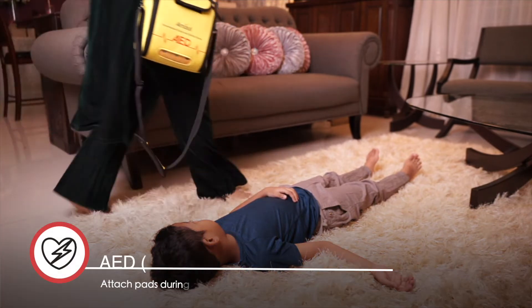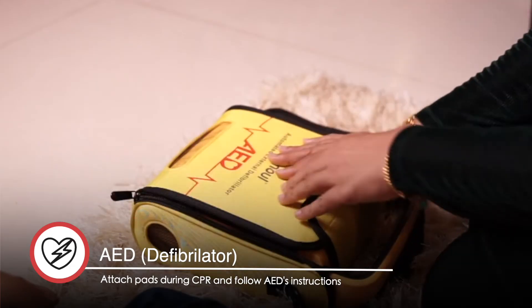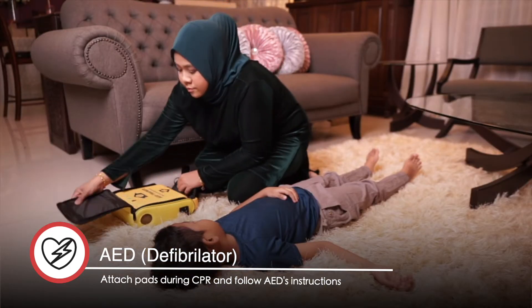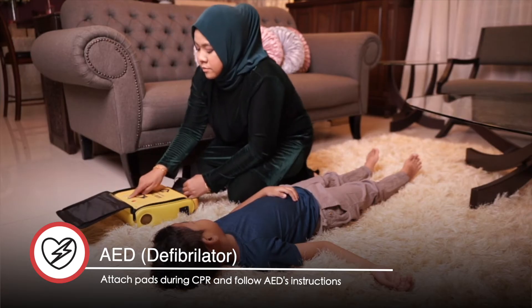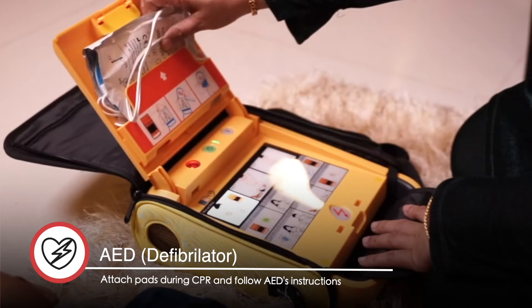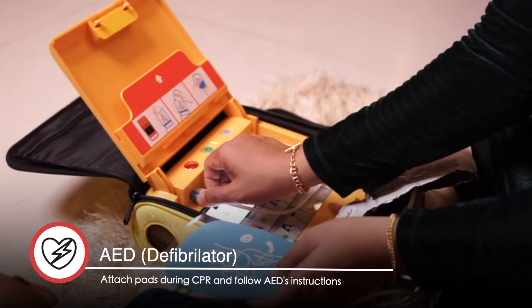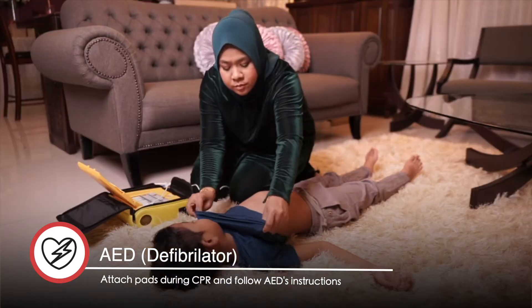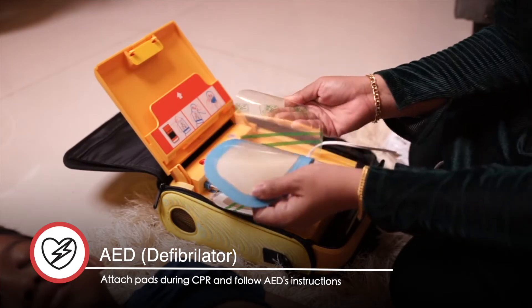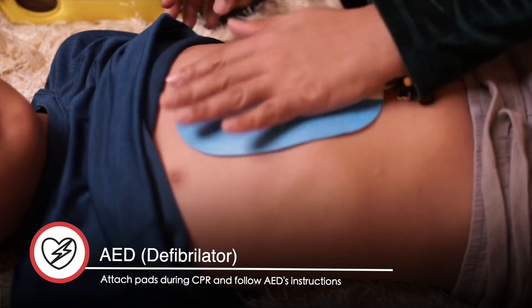Once the AED has been brought to the casualty, expose the casualty's chest by using scissors. Turn on the AED and follow the instructions that it gives or that come with it. Take out the electrode pads from their packaging. Expose the casualty's chest, remove the protective film and place each electrode as illustrated in the diagram included on the packaging or on the electrode itself.